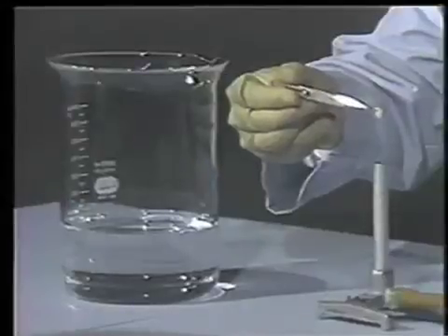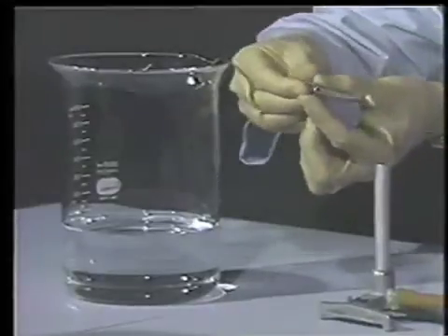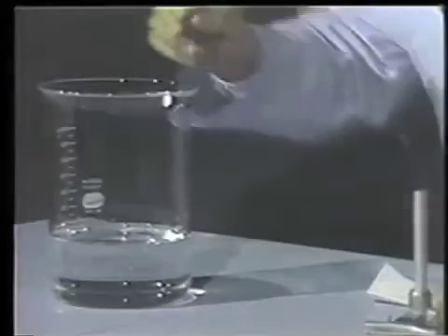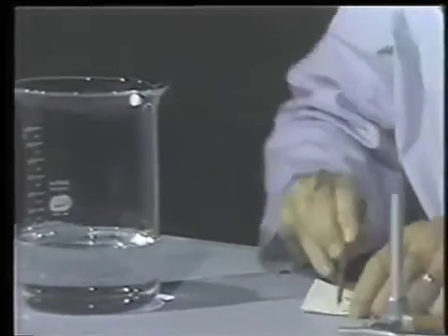And now we're going to quench it in this beaker of water right now. Now we're going to remove the crown and dry it off and take a look at it.